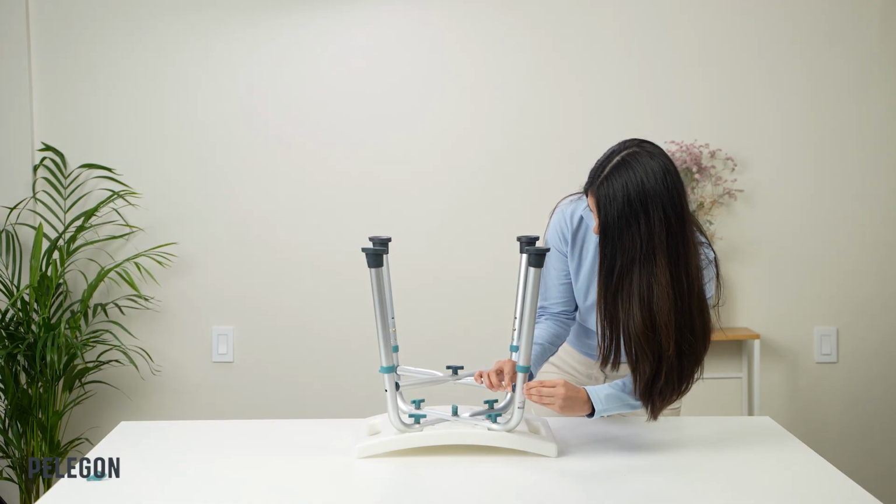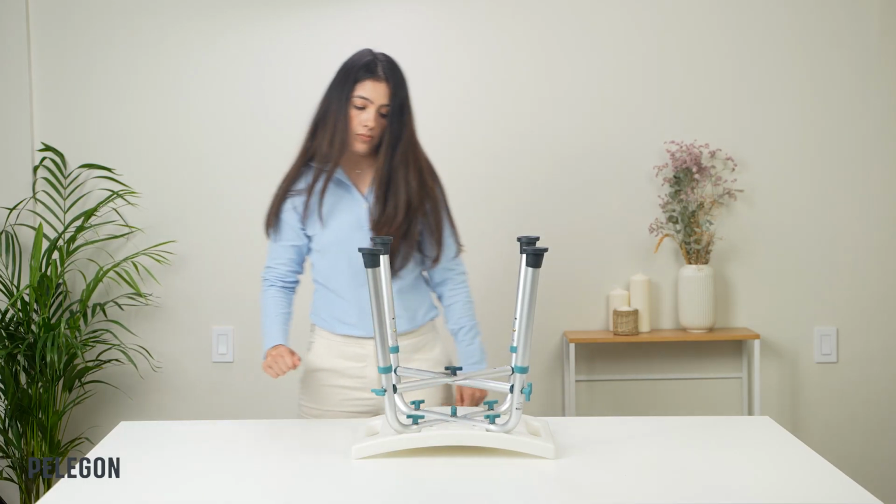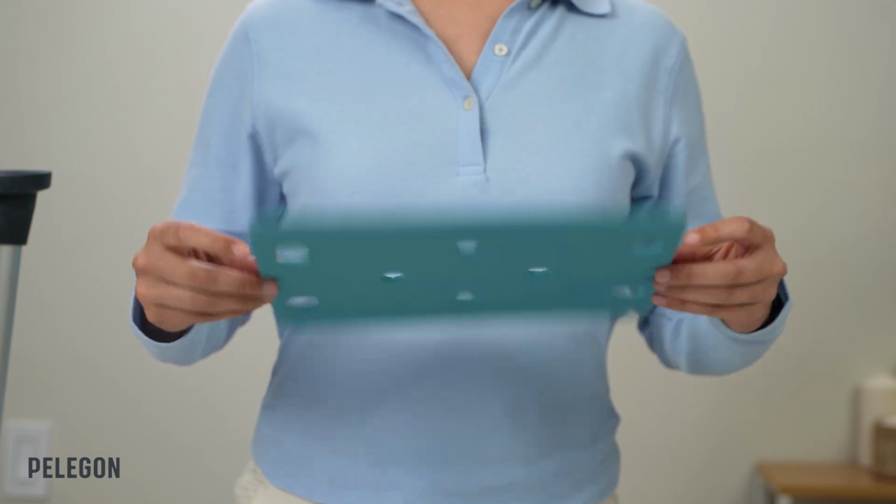Once all 4 screws are in place, give it an extra squeeze to tighten the structure a bit more. You can choose whether to use a seat pad or not.